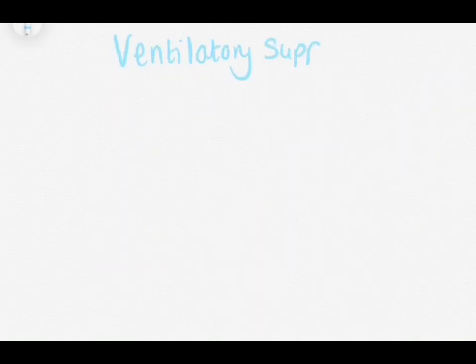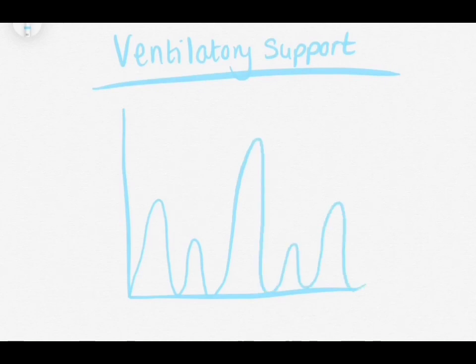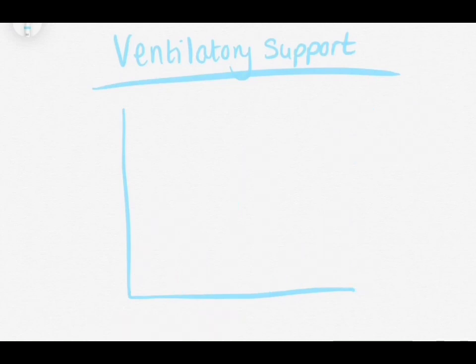We'll now go on to look at different types of ventilatory support available. If we didn't intervene with ventilatory support, we'd continue to see a varying respiratory rate and tidal volume. We're therefore not changing any parts of those equations, so we can't expect a change for CO2.